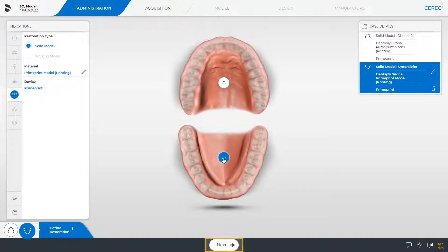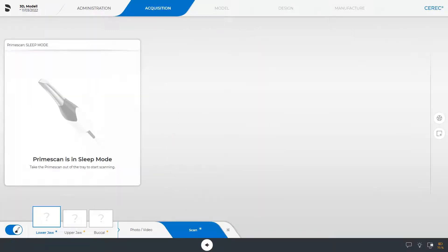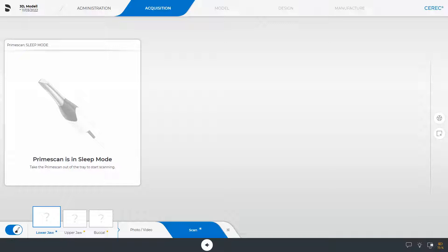Then we switch to the acquisition phase. This phase contains three image catalogs that need to be scanned. Since this video is focused on the workflow, we skip the scan process and show next the final scanned image catalogs.